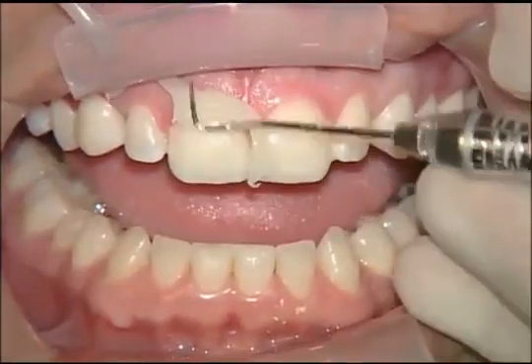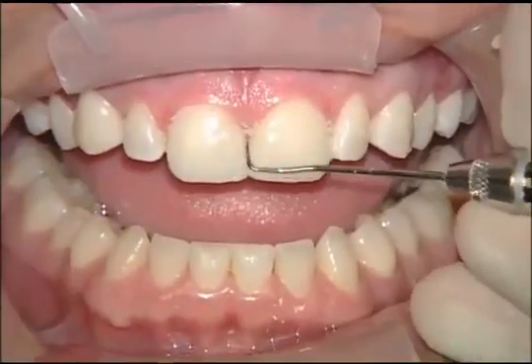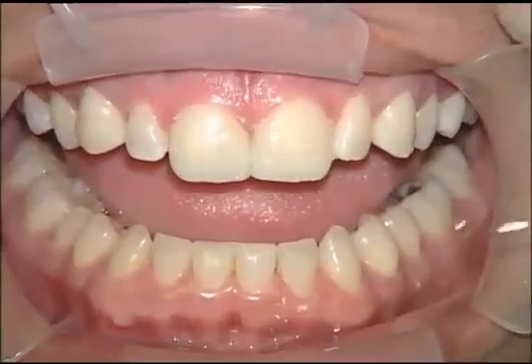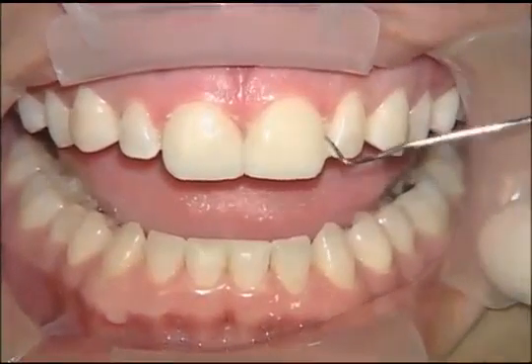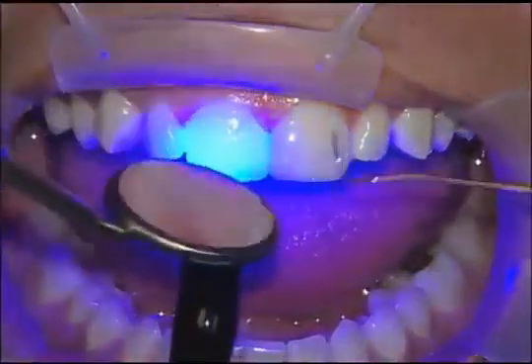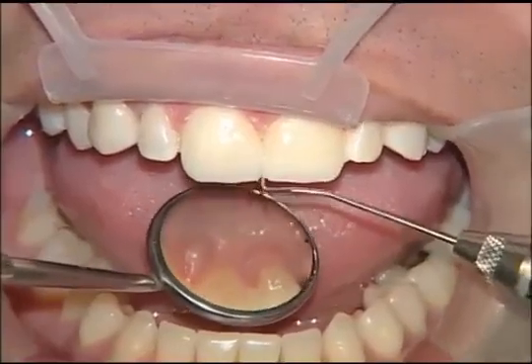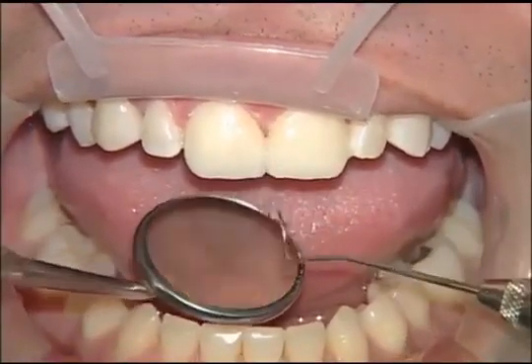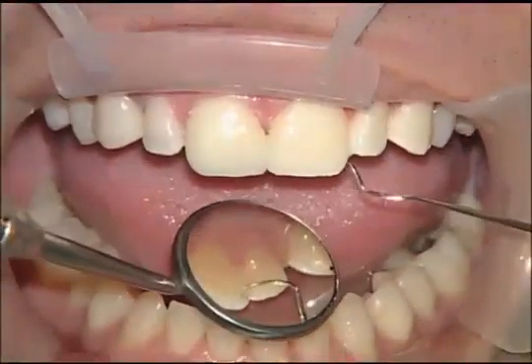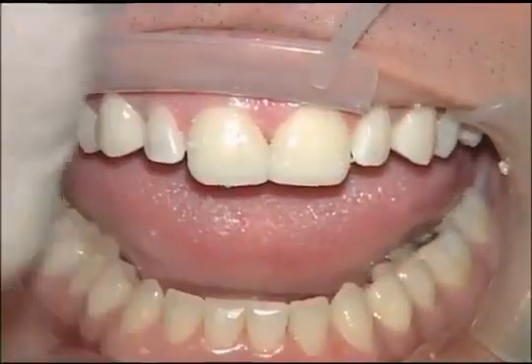Once we remove this large piece, we can then take the Explorer and go around the margins, check in the gingival embrasures as we're doing here, and remove any other excess that's there. But certainly the ability to remove that large piece right at the beginning saves us a ton of time with cleanup as we go through this. We're going to cure the lingual for, again, 1.5 to 2 seconds, and I'll remove any excess that we have back there as well. And once we begin to remove this excess, we've done most of the cleaning, and really all that's left is for us to go ahead and clean interproximally with some dental floss.